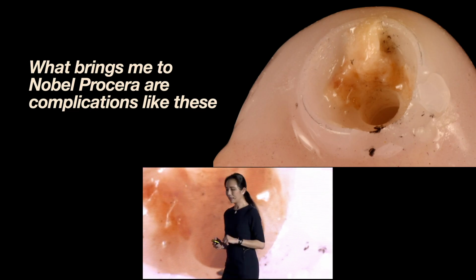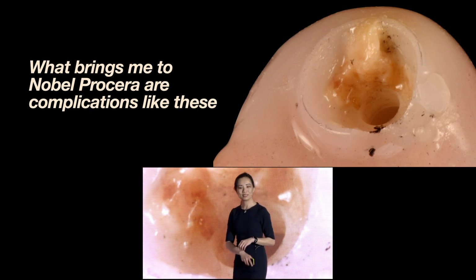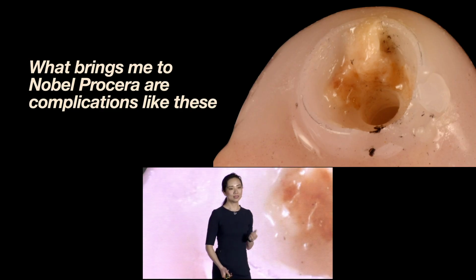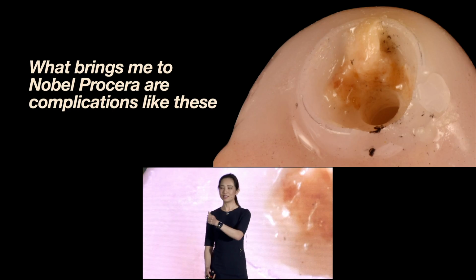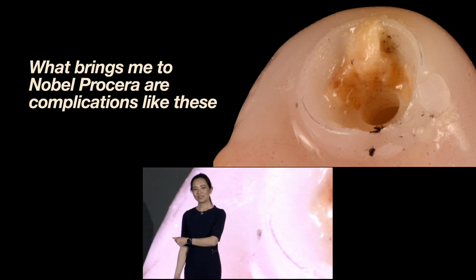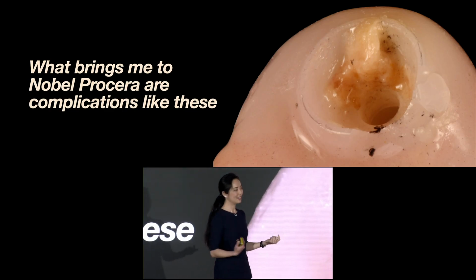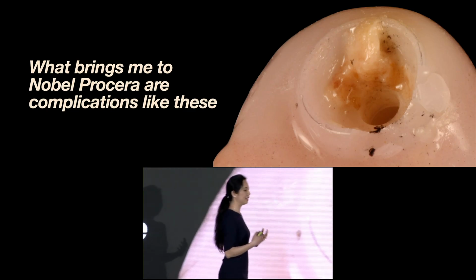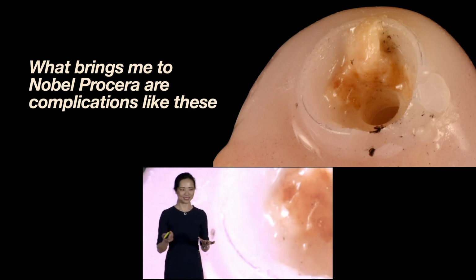For those of you who go, okay, well, we could just use a tie base and cement it in there, what is the margin of error you're inducing when you're trying to insert or cement each of these tie bases into the full arch? You can look at plenty of studies that show, oh, it could be as small as this number or as big as that number, but the reality is that there is a number assigned, and it's big.